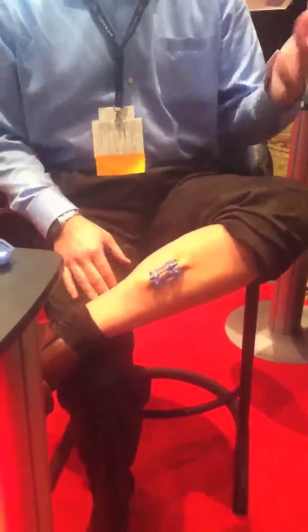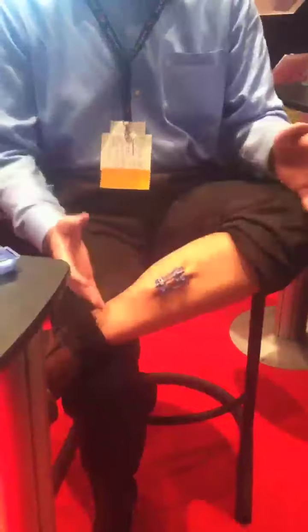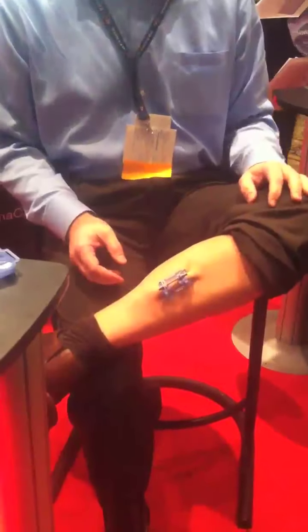It really is maybe about a one. It's not pain-free — you feel needles go in your skin. Right now I'm cognizant that it's there, but it's not an ongoing agony. That said, there are going to be some people who react to needles, but yeah, this is very tolerable. Especially considering I'm not distracted — I'm focused only on this and applying it to myself. It's much more comfortable than you would think.